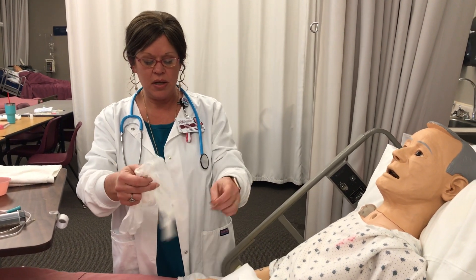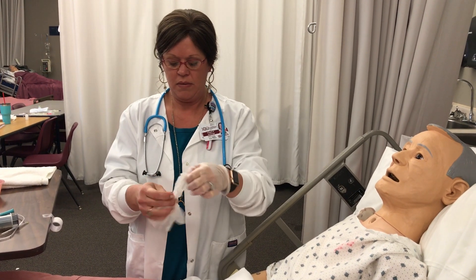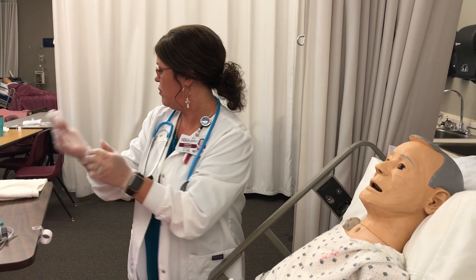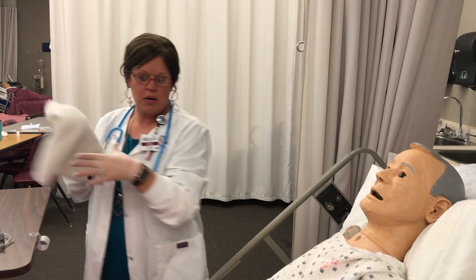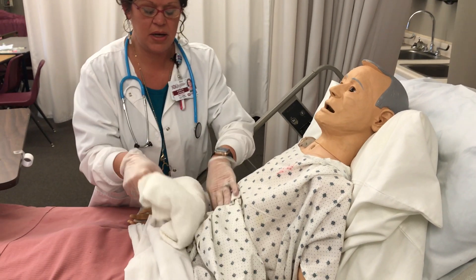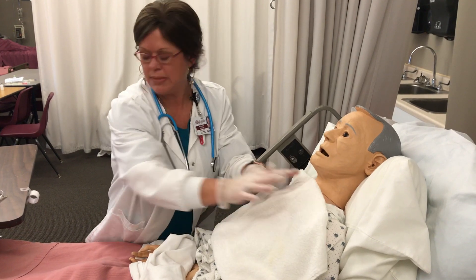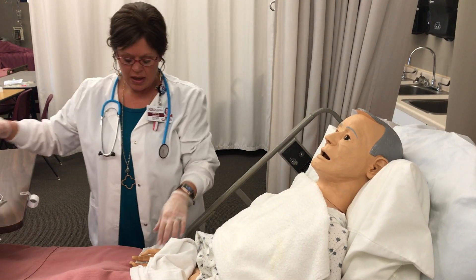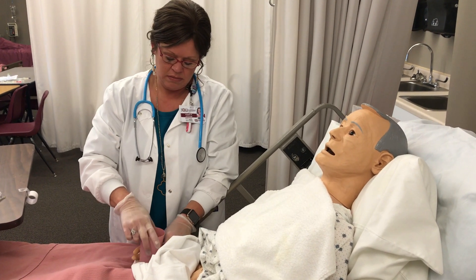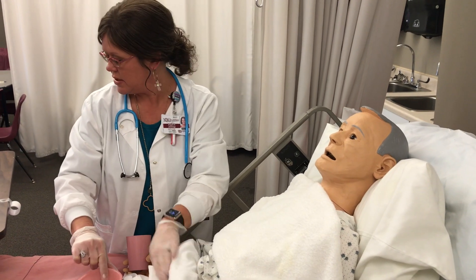Once I've checked patency, I'm going to go ahead and put on my gloves. I'll pull the tube back, lay the towel across my client, give them their cup of ice or water — either is fine — and put the little basin right here.